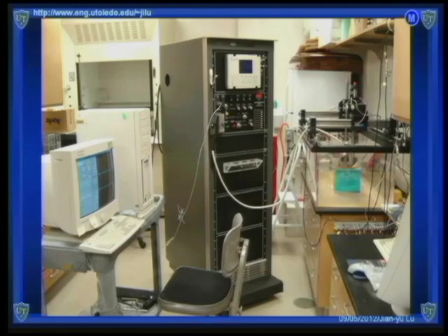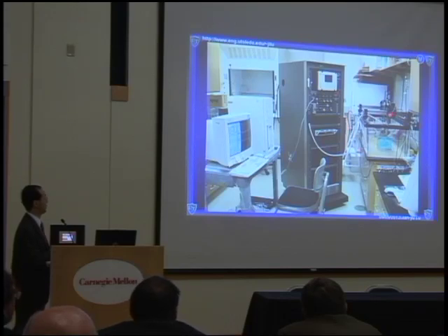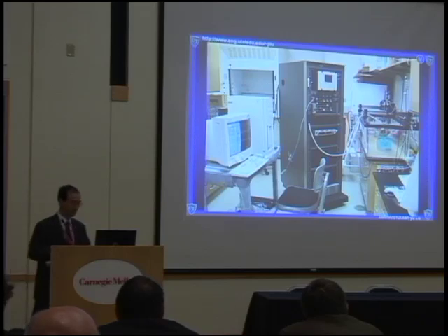And we use a computer, developing an interface to control the imaging system. And here is a transducer probe. Here's a phantom, which lets us see what we are reconstructing and how well we reconstruct the images, using the method I just mentioned. So here's the transducer on top, and this is the object.